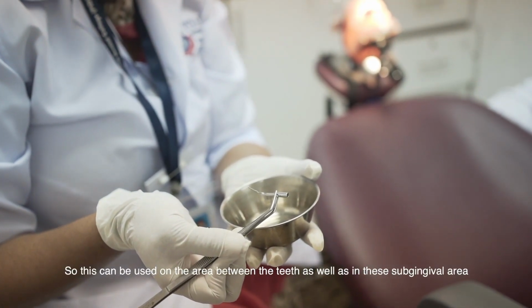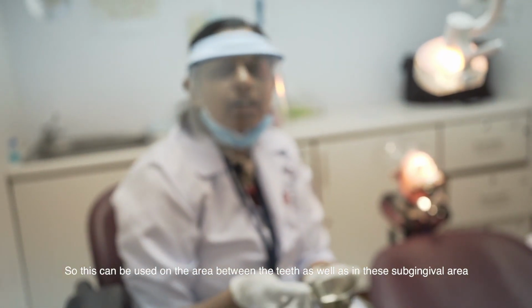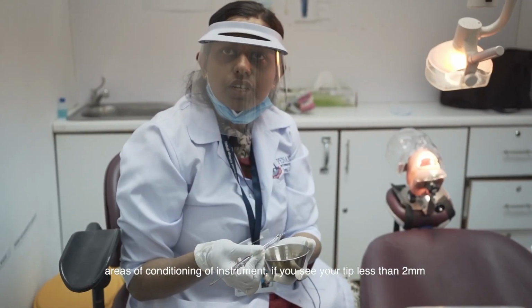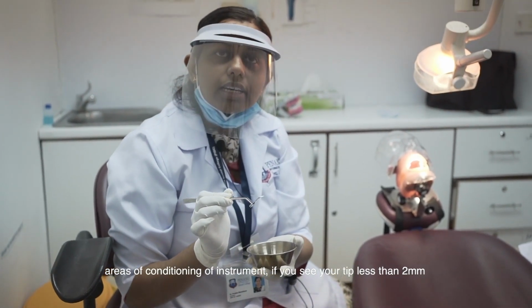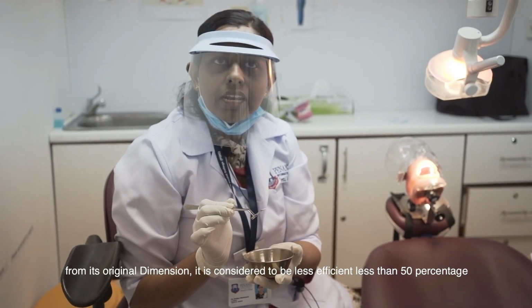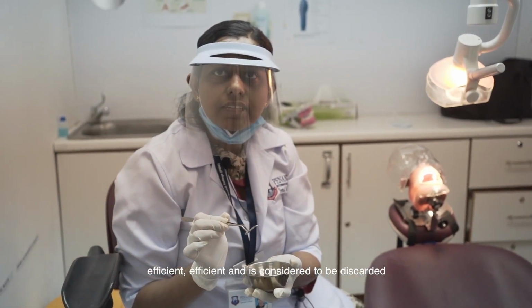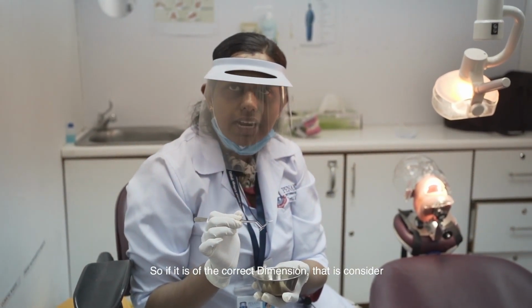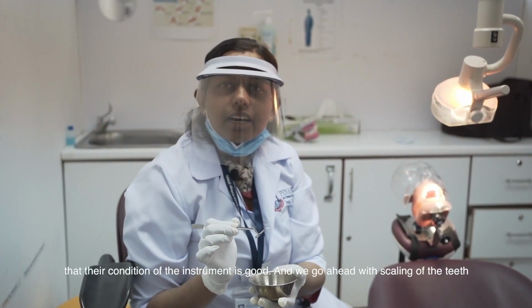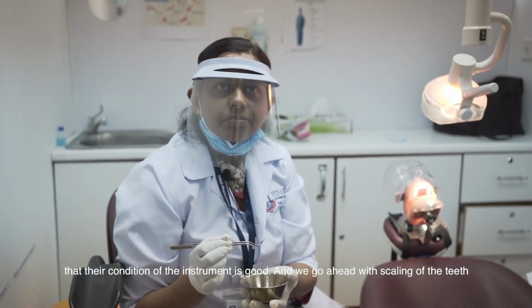So this can be used on the area between the teeth as well as in the subgingival areas. Regarding the condition of the instrument, if your tip is reduced by 2 mm from its original dimension, it is considered less efficient, less than 50% efficient, and should be discarded. If it is of the correct dimension, the condition of the instrument is good, and we go ahead with scaling of the teeth.